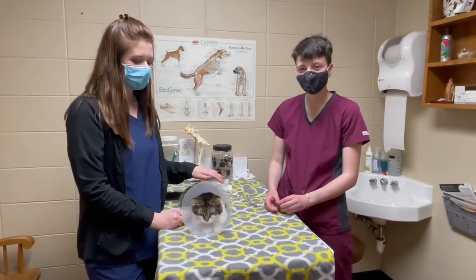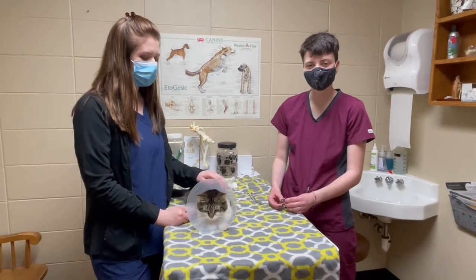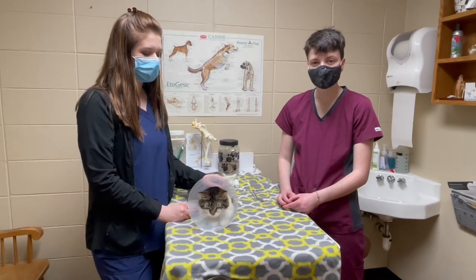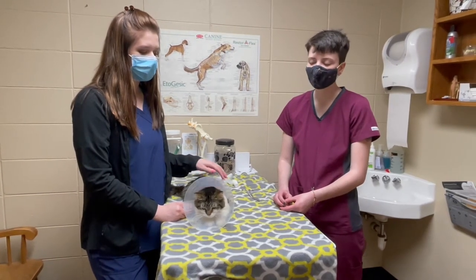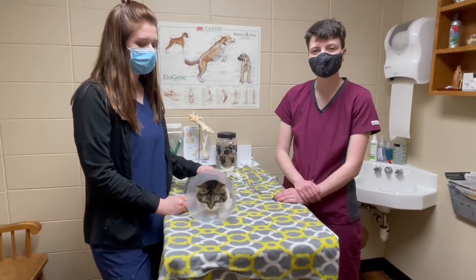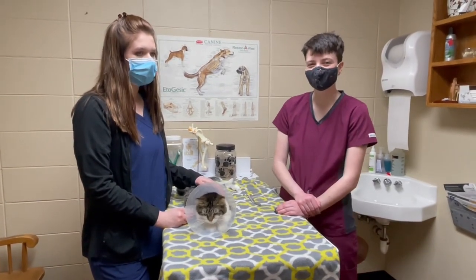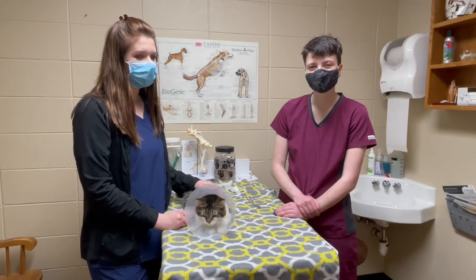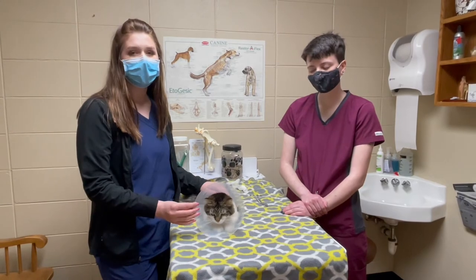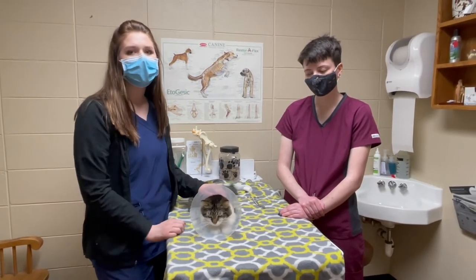You want to leave the cone on until you're rechecked and we take out whatever sutures they need removed. During that time, their cone will probably get pretty gross, especially with dogs and all the slobber. So you can take a wet rag and just gently clean around the sides — you just don't want them living in a yucky cone. Sometimes with bigger cones too, if they hit them against walls or something, they'll crack. So you can just put some duct tape over that.